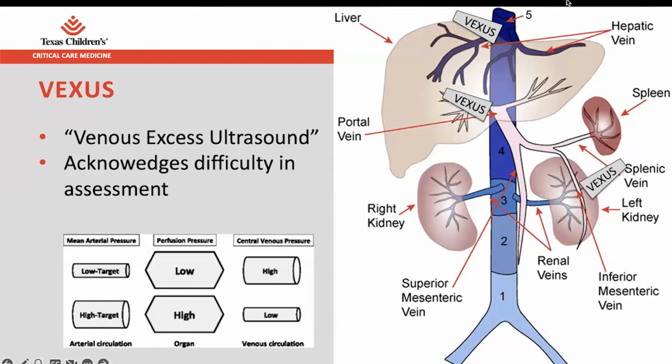And so we'd be differentiating that situation, especially if volume was an ongoing problem with that patient in terms of being overloaded. Or alternatively, if everything is congested, we could have very high driving pressures, but also high interstitial pressures in a perfused organ and end up with low venous flow. And how do we balance all these things out?